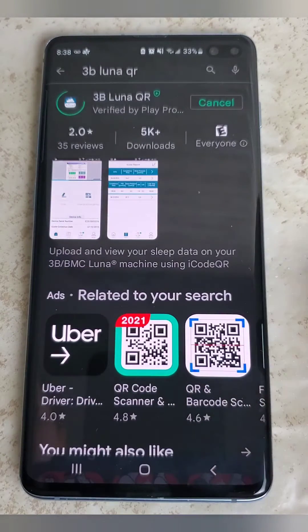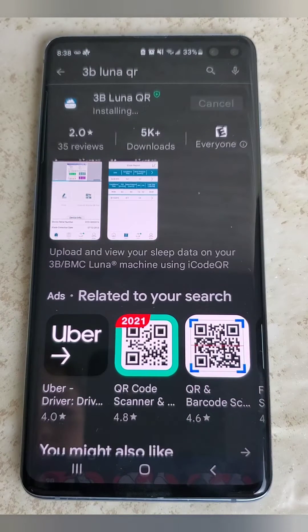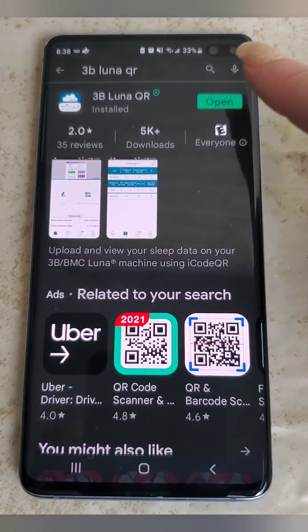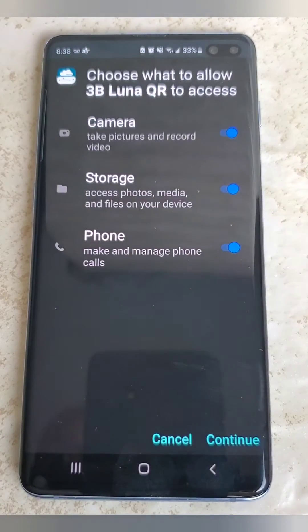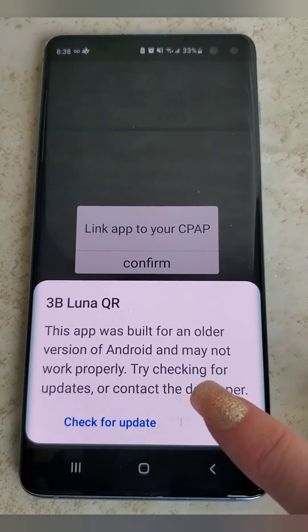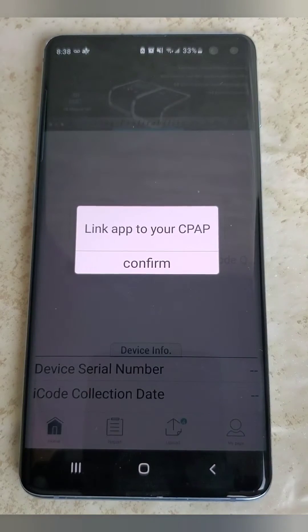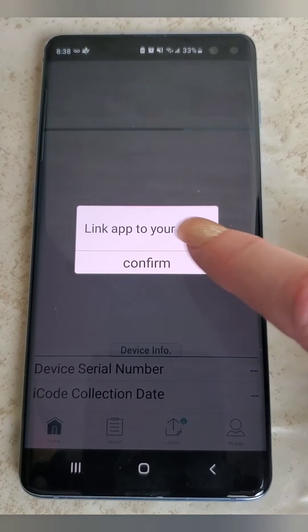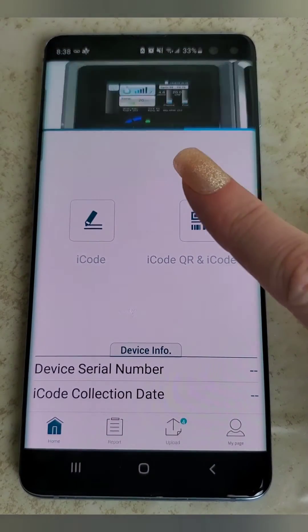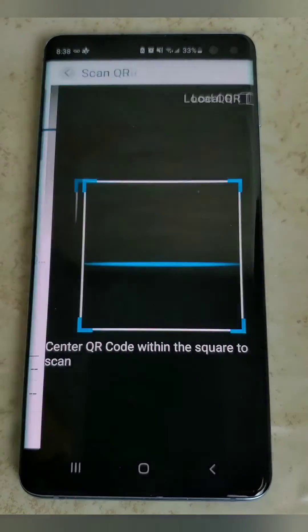Work your way through the permissions that pop up as you go, and once it's ready it's going to ask you if you want to open it. Go ahead and open it up and continue. There's no recent update, so you can just say okay if you see the 'check for update' alert. Then you're going to hit confirm to link your app to your CPAP machine if this is your first time, and then we're ready to hit the iCode scanner and scan.